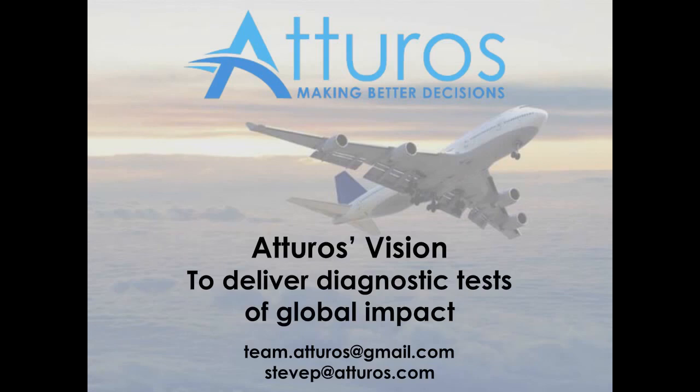Again, a good question, and this really revolves around the difference between plasma and serum, and the challenges in using both of those blood matrices. At the moment, we are beginning a process to evaluate whether the test works on plasma. There's a priori no reason why it shouldn't, but for considerations that I probably don't have time to go into, our preferred matrix has always been serum.